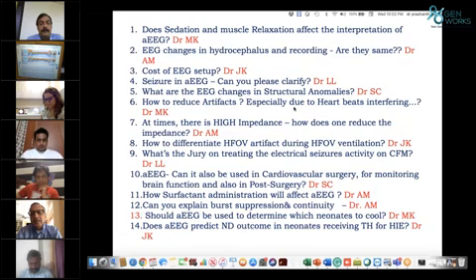Yeah, so I think Dr. Monica mentioned skin preparation is probably the key thing here. So making sure that the skin is prepped and scrubbed appropriately. I think spending a little bit of time before you put the leads on initially is important.